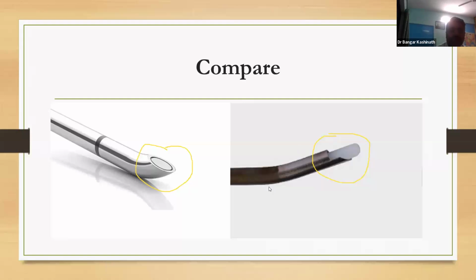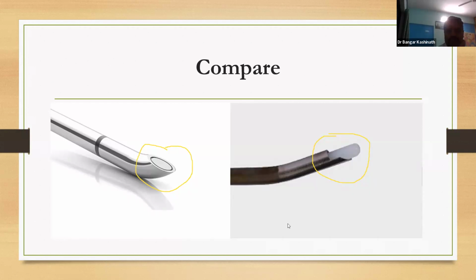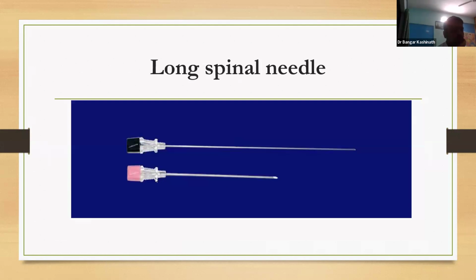Is this clear? Yes, sir. Fantastic. This is the long spinal needle. I'll just remove this. So, what are the uses of the long spinal needle? And what is the length? Any idea?